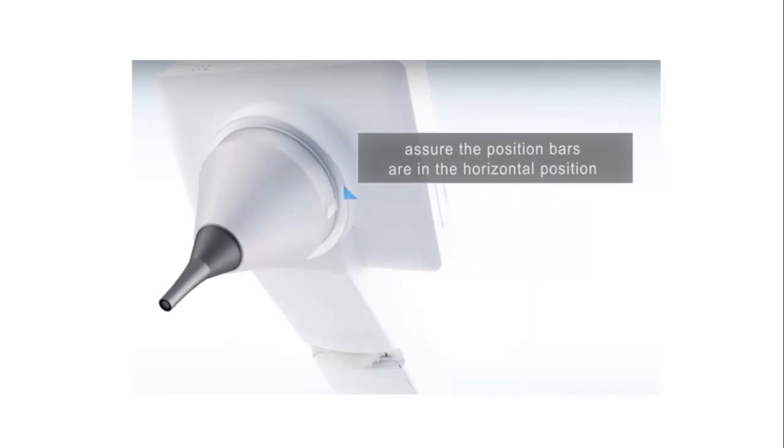Rotate the lens attachment gently in the clockwise direction to fasten the lens until it stops. Ensure the position bars are in the appropriate horizontal position.